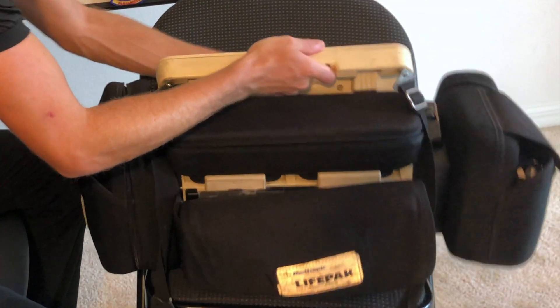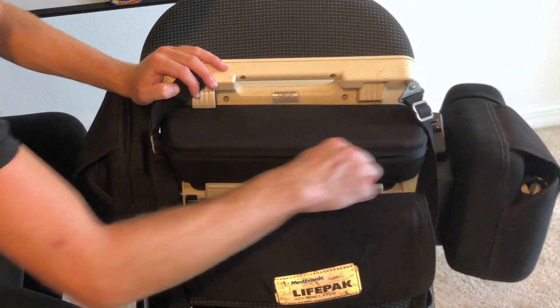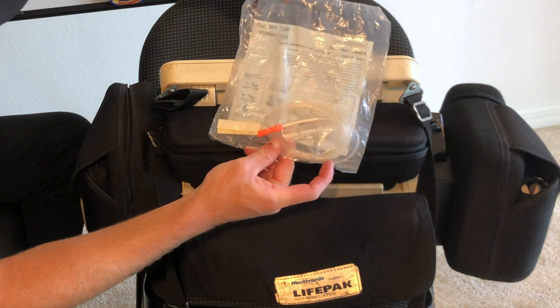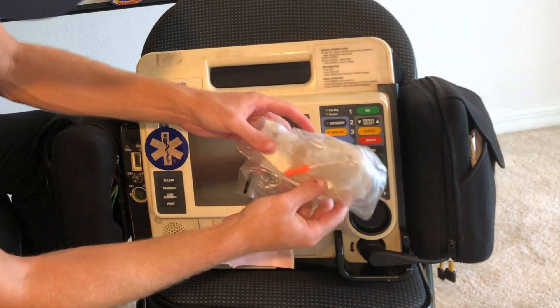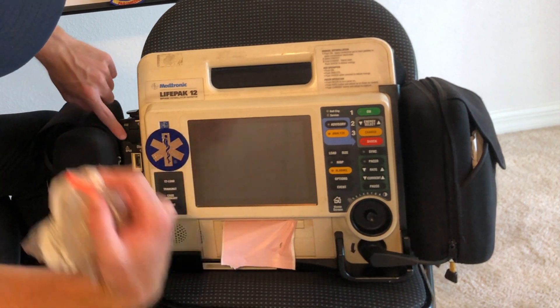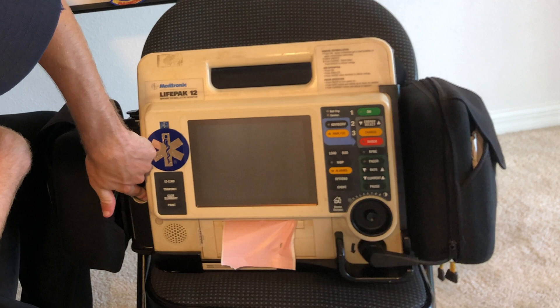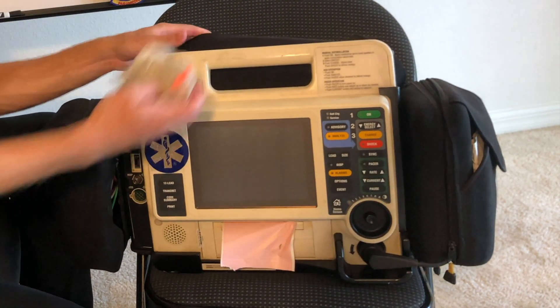So let's go to the back here. Now in here, the top portion — I actually have what's called end-tidal CO2. This connects in; the orange piece connects in right here. So we have end-tidal CO2, SpO2, blood pressure hookup, EKG hookup. This is where the pads hookup is. Those are all your hookups.